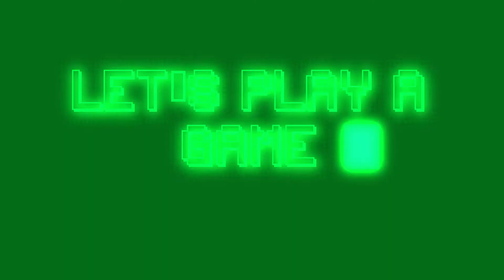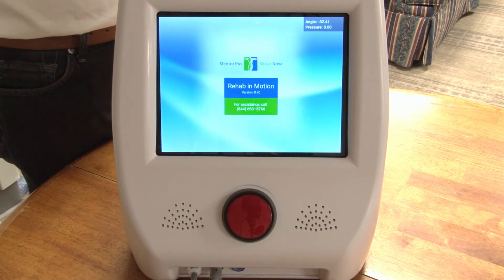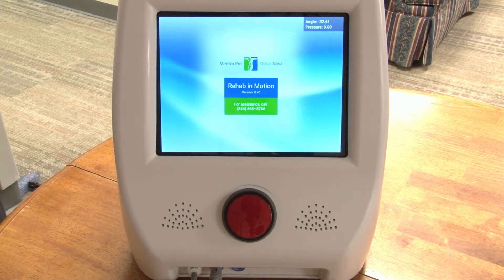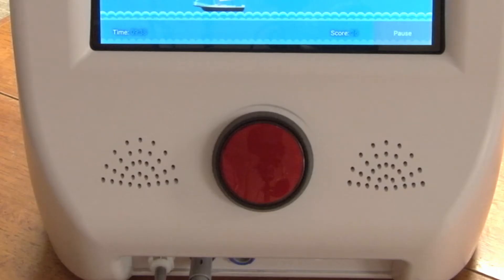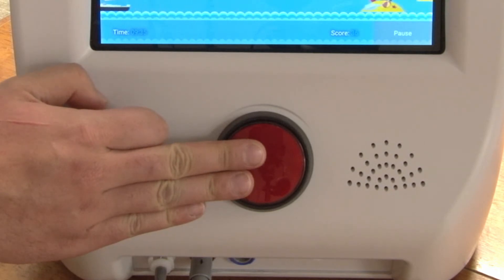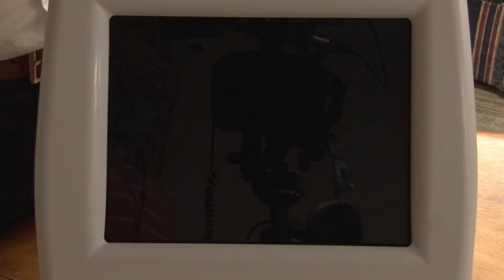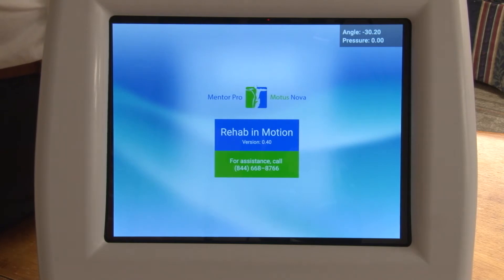Now let's play some games. After you put the device on, power on the controller and you'll see a logo screen before the game selection screen. If at any point you feel uncomfortable, hit the big red emergency button in the front. This will release all pressure from the device and display an emergency button pressed screen. When you're ready to resume your exercise, switch off the device in the back and switch it back on.